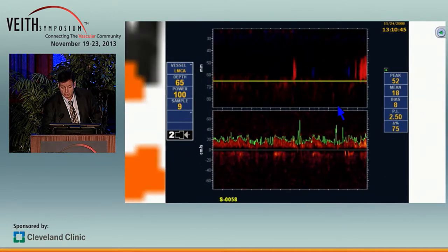Very important: when you put the shunt in, there is no other information than TCD that can tell you if the shunt is even working. This is the case when the shunt is placed, but there is no flow through the shunt.